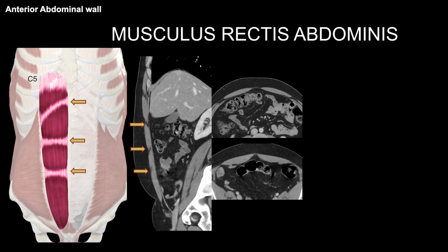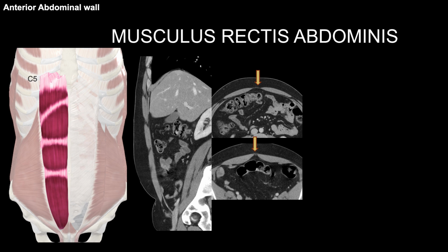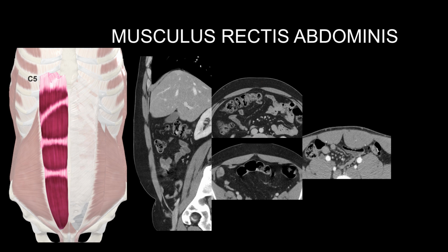These two rectus abdominis muscles, forming the most anterior and medial part of the abdominal wall, are separated by the linea alba. It is important to note that the linea alba may be relatively wide above the umbilicus, whereas the two rectus muscles are closely opposed below it. Another important point is that asymmetry in abdominal muscles is possible, particularly in athletes practicing asymmetrical sports like tennis, where only one muscle may be significantly hypertrophied compared to the collateral side.